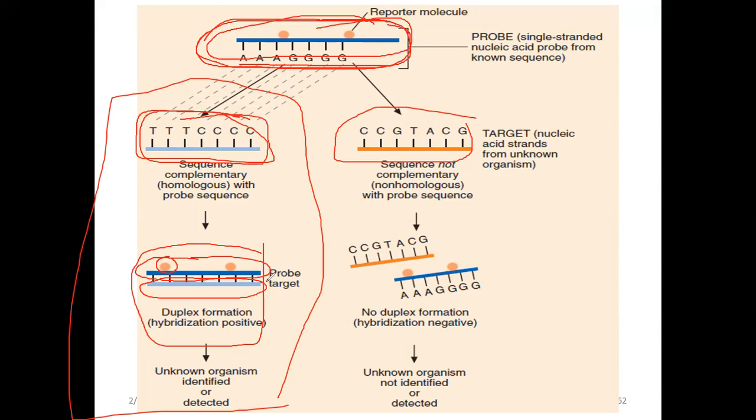Okay? So, pag dinetect mo siya sa fluorescent microscope, makikita mo. Kung fluorochrome siya, for example, using your FITC, makikita mo yung apple green doon. Ibig sabihin, ang organism na nag-cause ng infection is your E. coli 0157. Halimbawa lang nga, okay? So, kunwari guys ha, yung probe kasi na ginamit mo ay para dun sa strain na yon. Okay? O for example naman, yung another specimen mo naman.